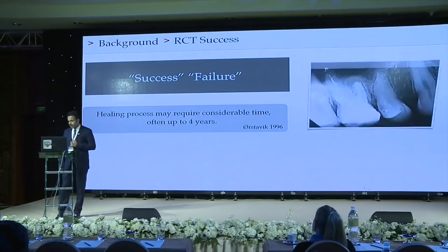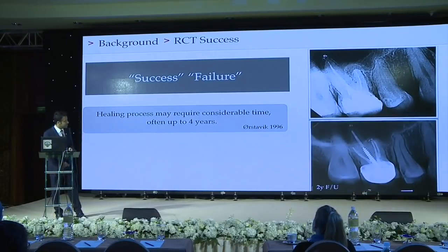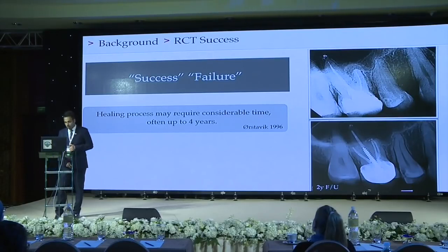That is a fact. Take this case as an example, a case that I treated. As you can see, there is a lesion associated with the mesiobuccal root. And after 2 years, the lesion did not completely heal. So if someone else takes a picture of that tooth at another place, they might think that this is a failed root canal treatment, whereas it's in the healing process.